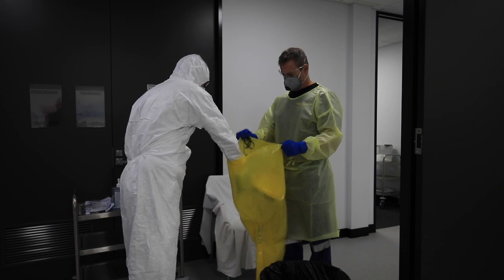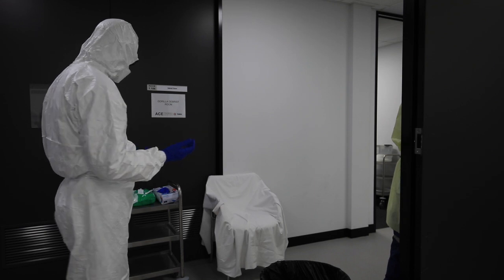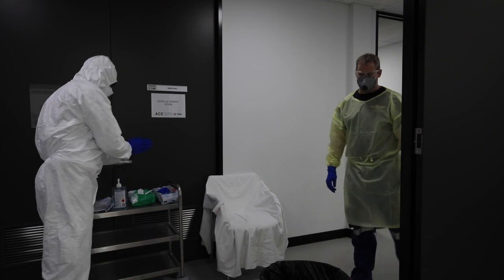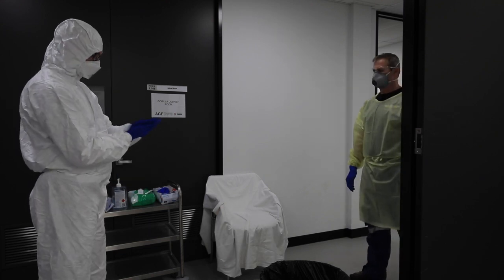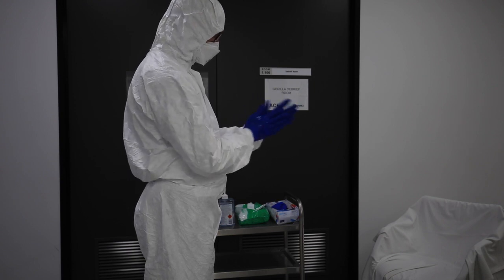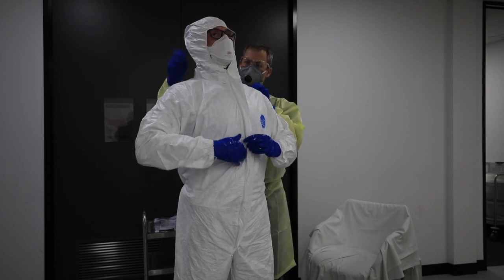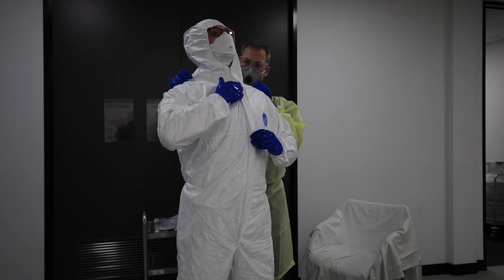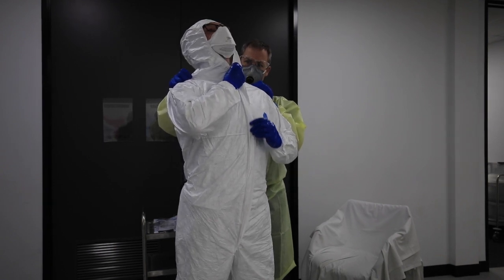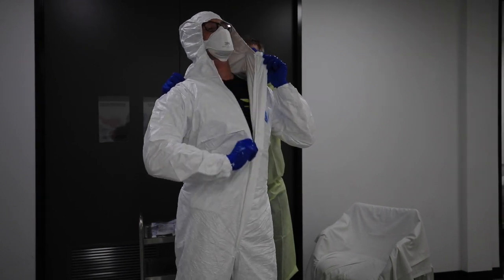Visor going into a bag. Now I'm going to perform some hand hygiene on my inner gloves. With my assistant providing a little bit of traction on the back of the suit, I'm running my hands up the zipper to identify the zip rather than going straight for it and potentially touching my skin. Unzipping to the waist.